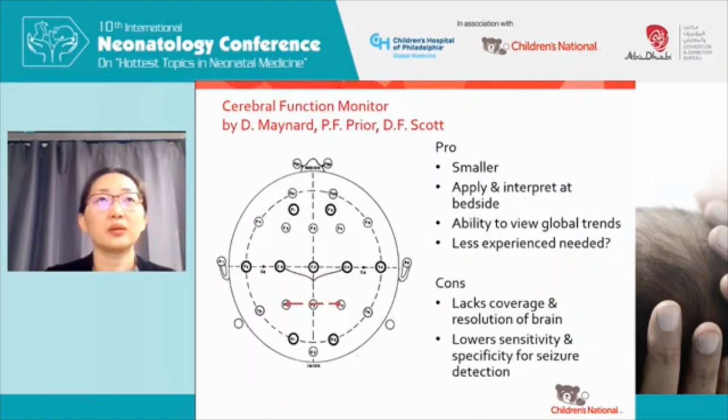So again, Maynard, Pryor, and Scott limited their electrodes to 2 electrodes rather than 18. And why did they choose that? Because this was developed for the adult male patient that was coming out of cardiac surgery. By putting the electrodes in the parietal regions, they avoided any nearness to the temporalis muscles that would be triggered if you were to bite or chew down on your ET tube.